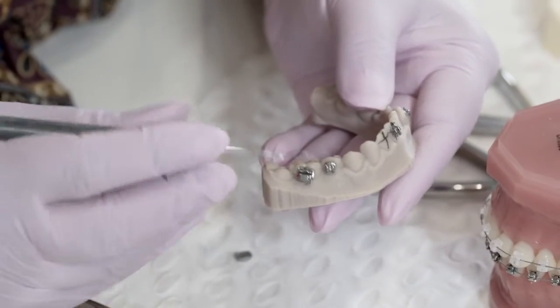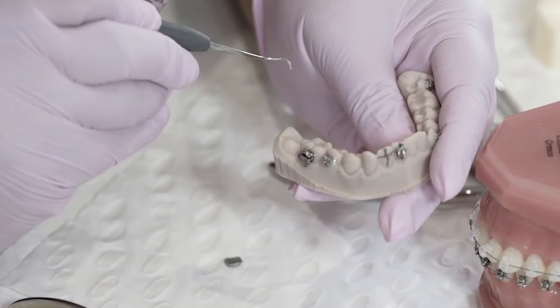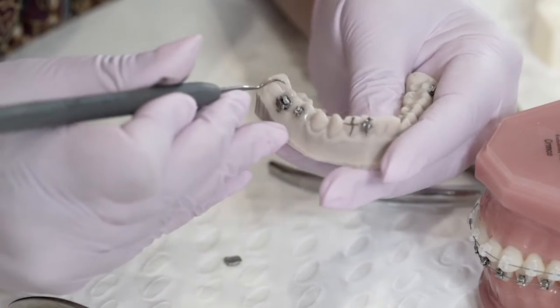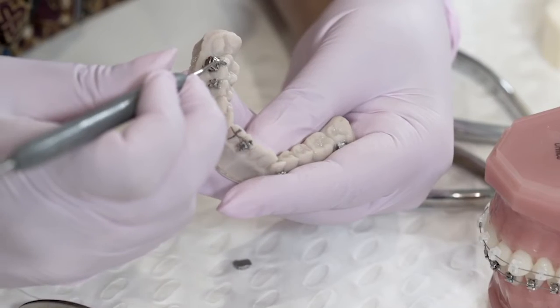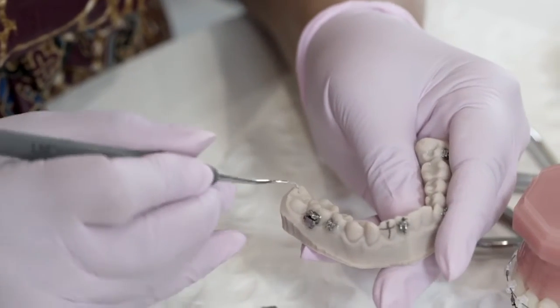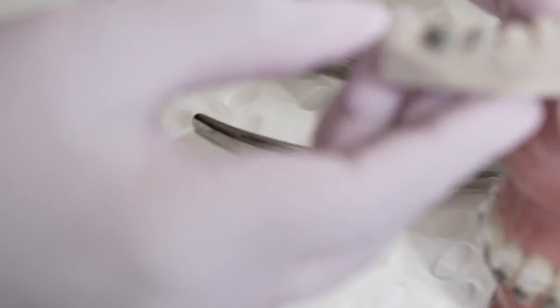If the six's anatomy is flat, that makes it a bit challenging to get the bracket right. You can now see an equal amount of distal buccal cusp and equal amount of mesial buccal cusp. Checking from the front, pushing it down a bit more — to me that looks a lot better. It's lined up with the buccal groove and the little notch. Pushing it in allows it to adapt to the anatomy of the tooth, and then we cure.